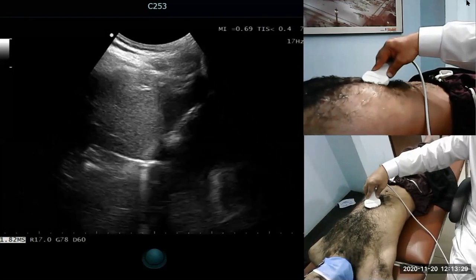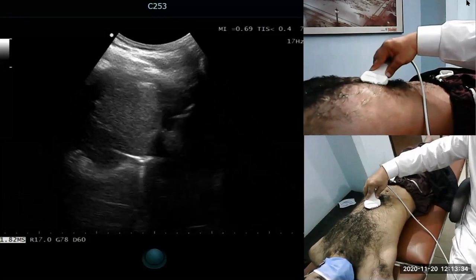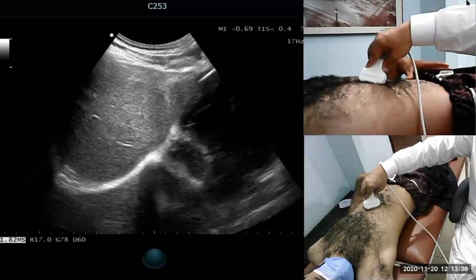There. Press it. Now it is easy. And now slowly my hand will rise.